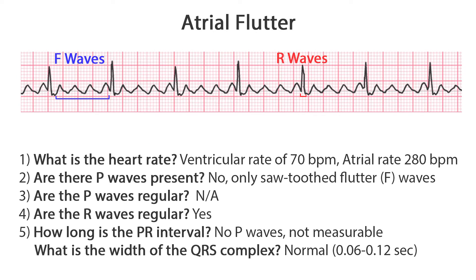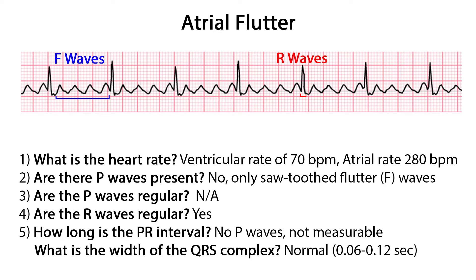Now we'll use the 5-step approach to evaluate atrial flutter. Step 1: What is the heart rate? Counting the R waves, or QRS complexes, in 6 seconds, there are 7 — so 7 times 10 equals a ventricular rate of 70 beats per minute. Step 2: Are there P waves present? No, only sawtoothed flutter or F waves. The atrial rate can be figured out by counting the number of F waves in 6 seconds and multiplying by 10. There are 28 F waves, so the atrial rate is 280 beats per minute.